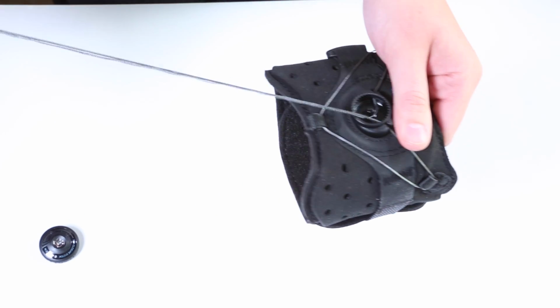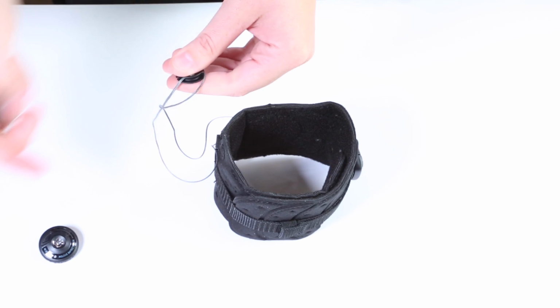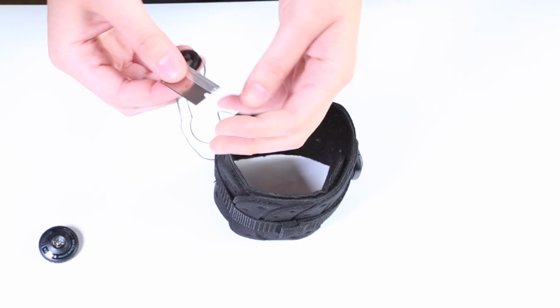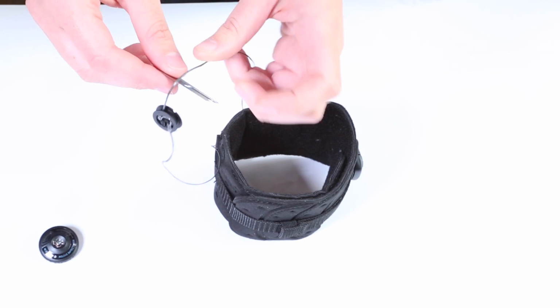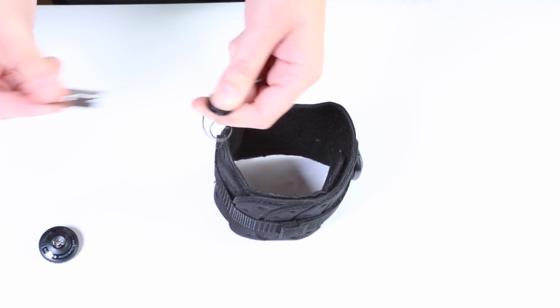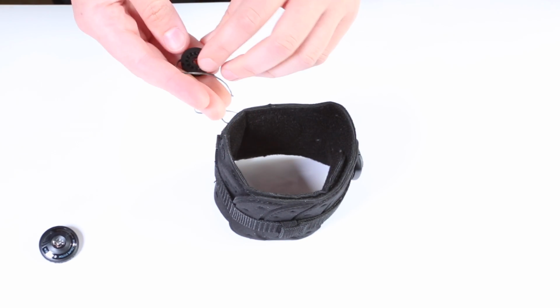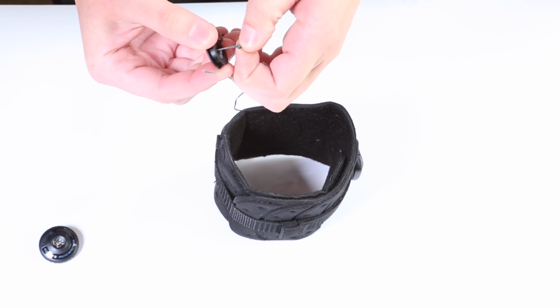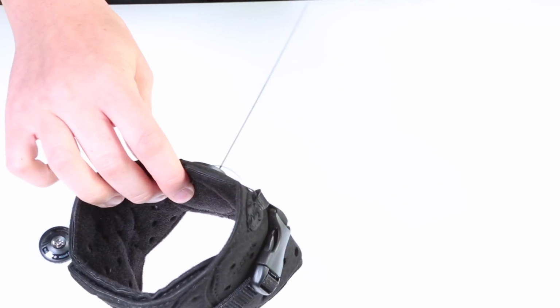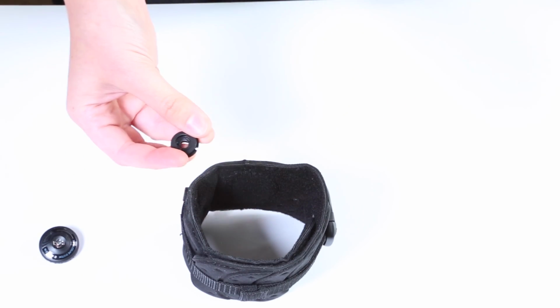So to do so, I'm just gonna unwind this and cut this cord off. I like to use just a razor blade. You can use an X-Acto knife, anything that's sharper than scissors. So maybe even really sharp embroidery scissors if you sew might work, but just standard scissors probably won't. So now I'm gonna remove that cord from the spool. Now I can just go throw my old Spectra cord away.